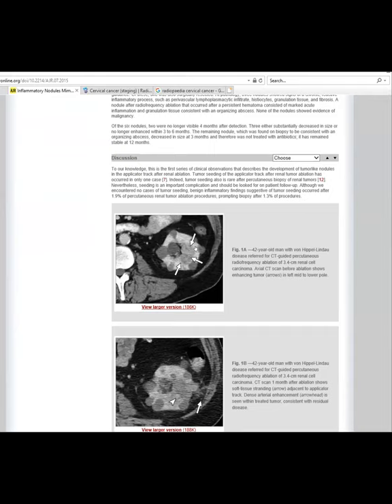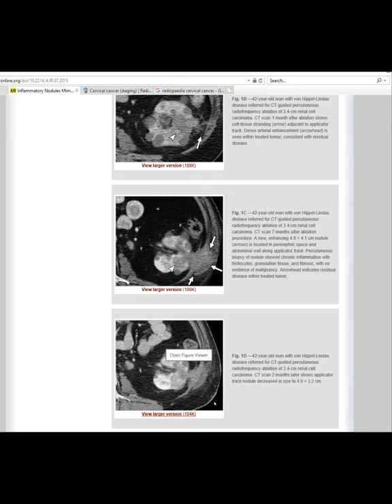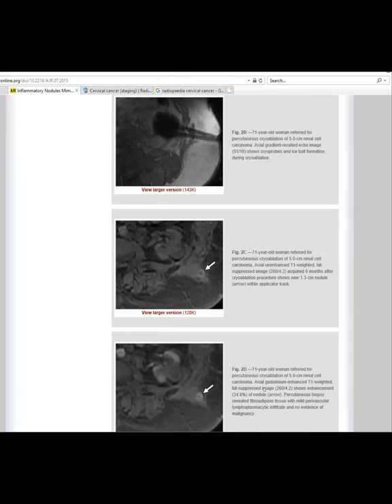So here was a tumor that they ablated. And then this was the inflammatory pseudotumor that developed. And typically they develop at least 6 months after the ablation, but it can be even up to several years after the ablation. So it can be a smoldering, low-grade inflammatory process that then also diminishes over time. They biopsied all six of theirs and they all came back negative.